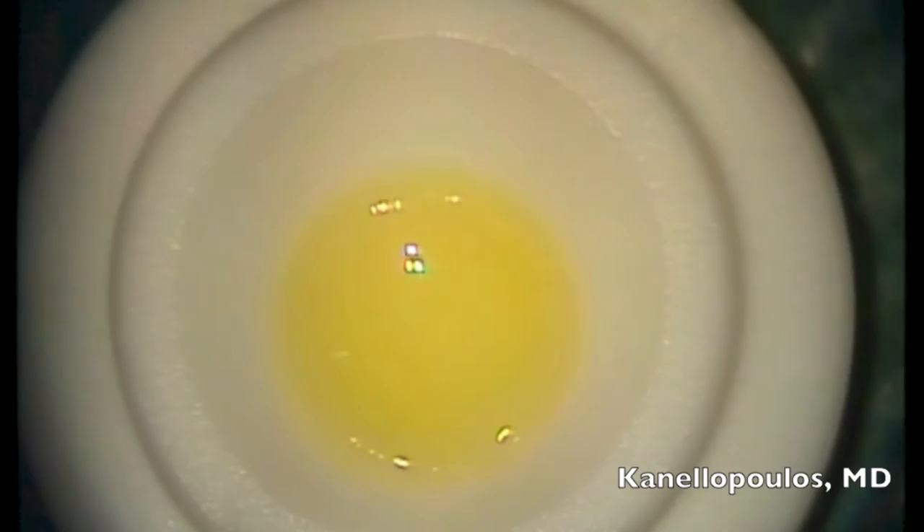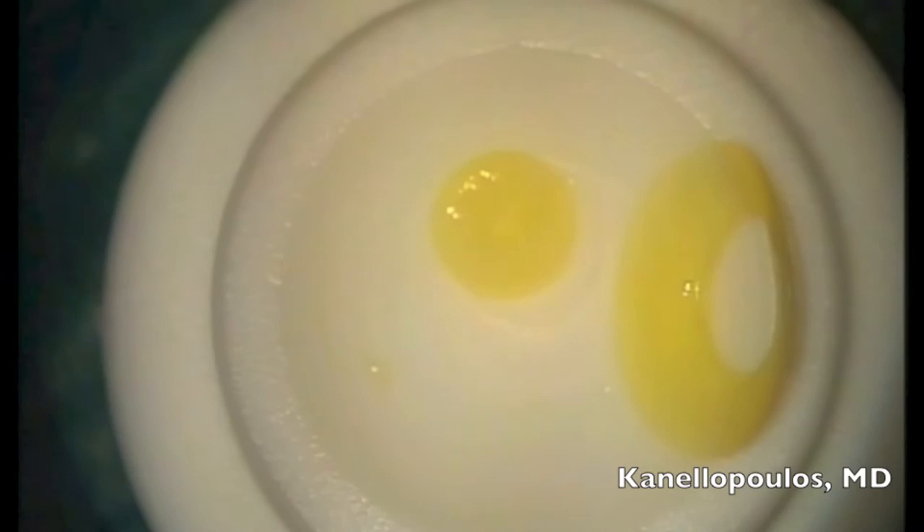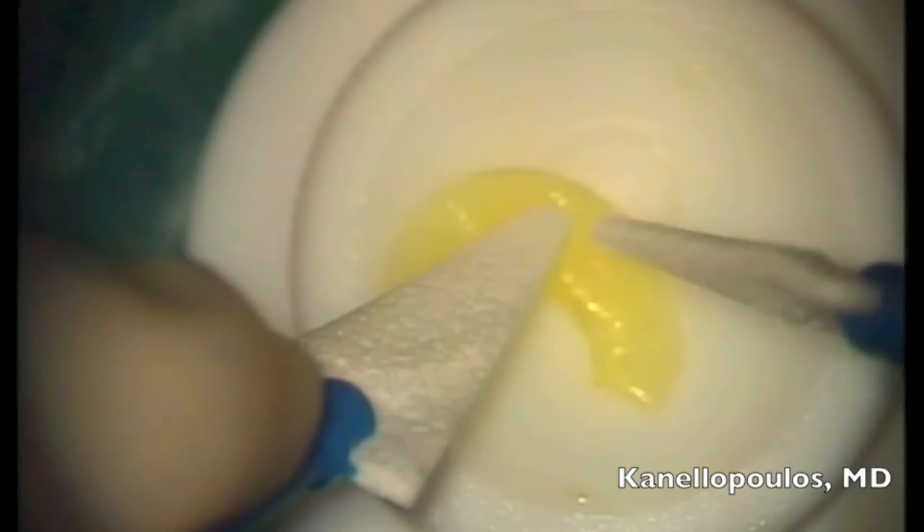Using a 5-millimeter handheld trephine, I'm going to try and create an annular graft from this cornea button — freehanding at this point — to remove this eccentric central button that we will not use in this case. I will use the residual rim to create an annular graft. You'll be able to understand the reason why the graft is formed this way in just a few seconds.